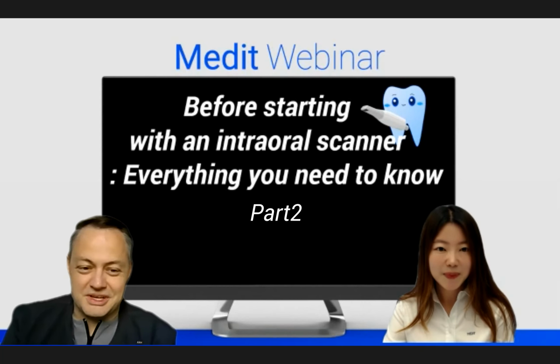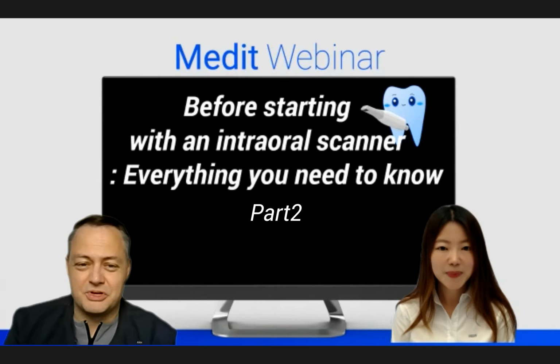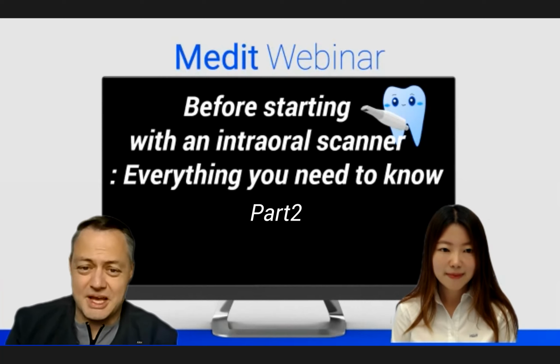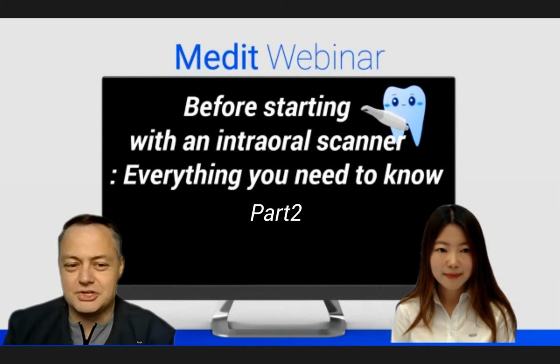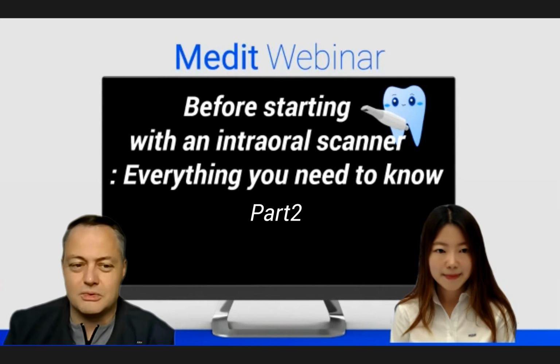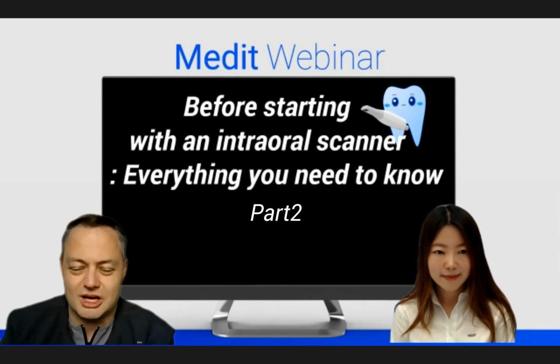So this time I'm going to be here for the second webinar in the series before you start scanning with intraoral scanners. And this time we're going to handle installation of software, what software you need, what do the apps do, every app, and also how to prepare and sterilize your scanner and scanner tips, how to work properly with your scanner, and also how to back up your projects to not lose data, and how to wipe your scanner off when everything is finished.